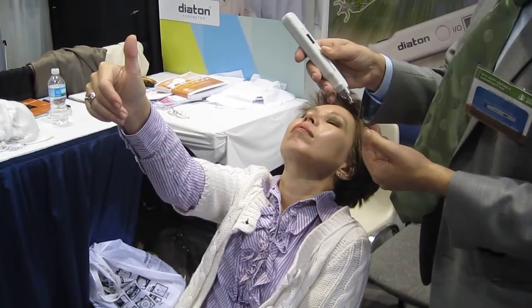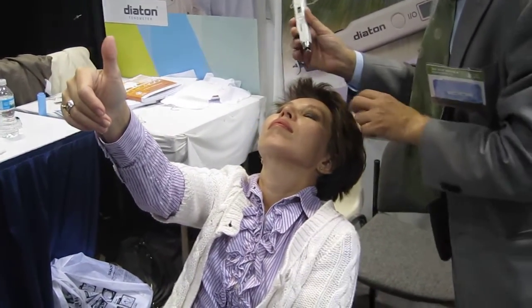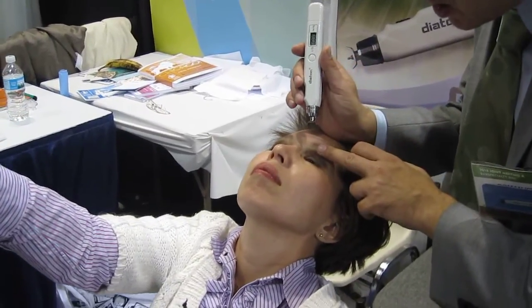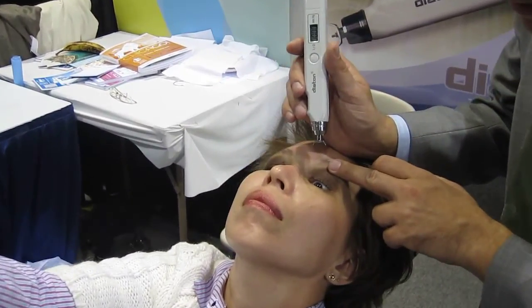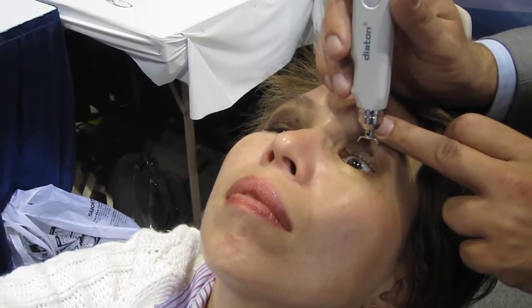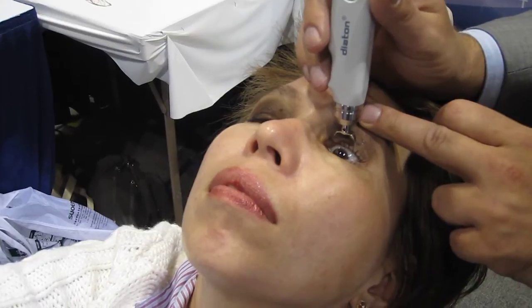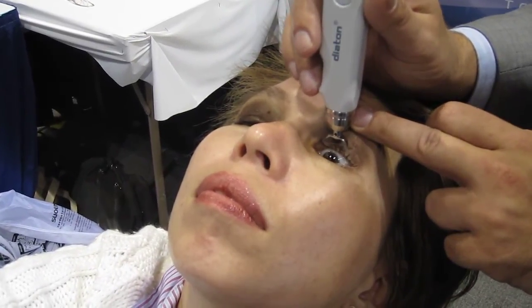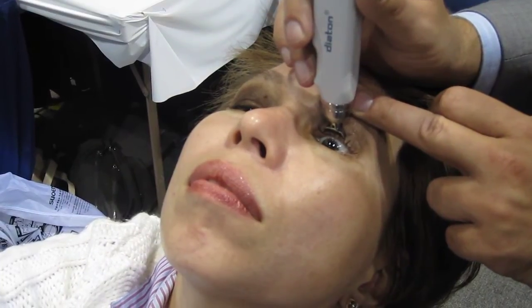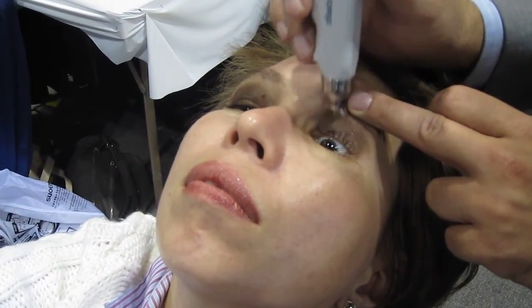Get the tonometer into the ready position. Use the edge of your palm to support on the patient's forehead. Gently pull on the eyelid as it naturally opens, making sure that the edge of the lid is above the edge of the limbus and does not slide onto the cornea. Place the tip of the tonometer right over the tarsal plate and gently release downwards.